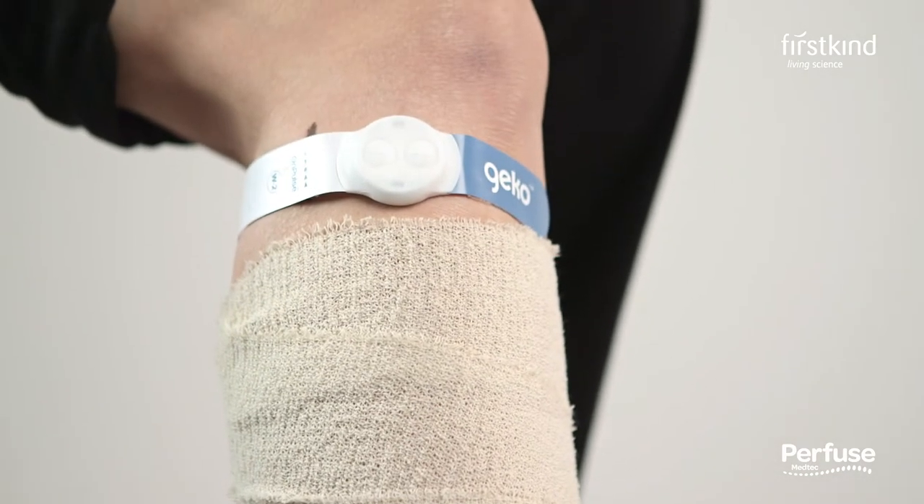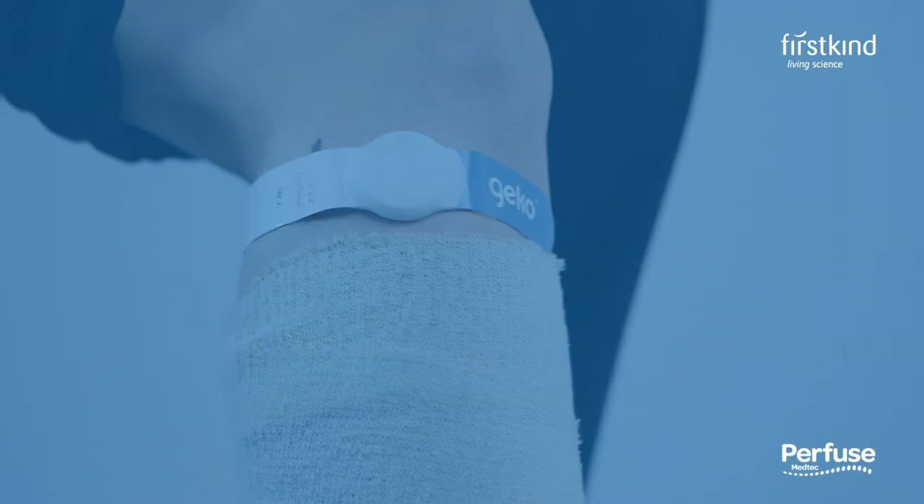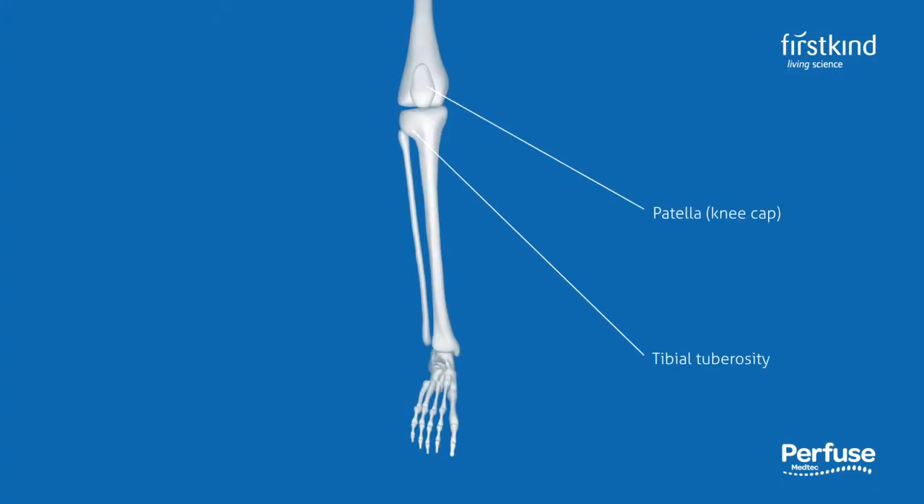Before fitting the device, first find the location where the device is to be secured. It can be found on the outside of the leg, just below the level of the knee, at the center of the fibula head.